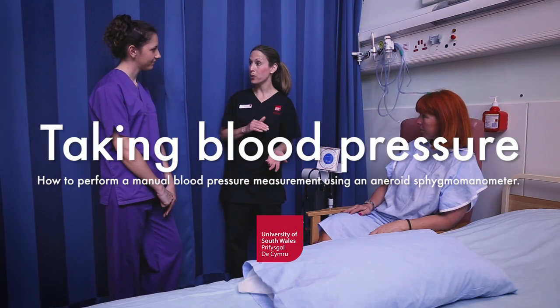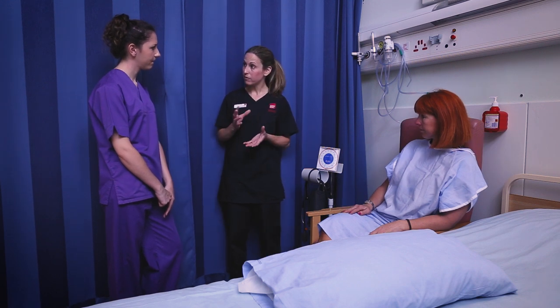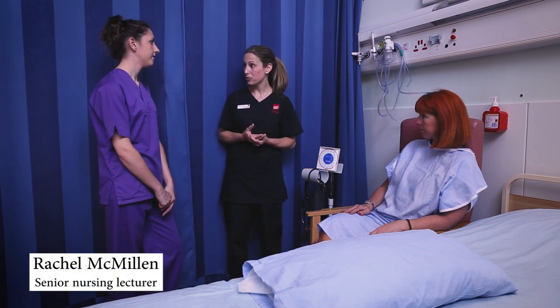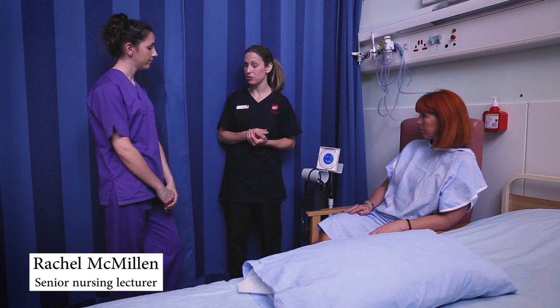Sophie, we're going to go through taking a manual blood pressure measurement today. We have done some theory around blood pressure before, so I'm just going to go through the practical steps now that we need to take in order to take a manual blood pressure reading.